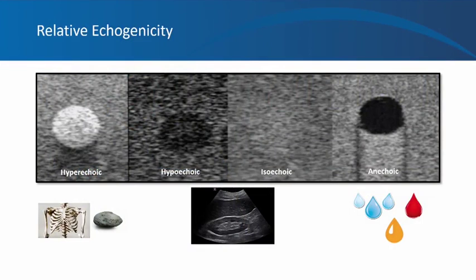Let's start with a brief refresher about terminology and renal anatomy. We describe grayscale ultrasound findings in terms of relative echogenicity — how echogenic a particular structure is compared to its surroundings. The more echogenic a structure is, the brighter it appears on the monitor. In this picture, the circular area in the middle is hyperechoic because it's brighter than the surrounding area. In other words, this structure is making more echoes compared to its surroundings.